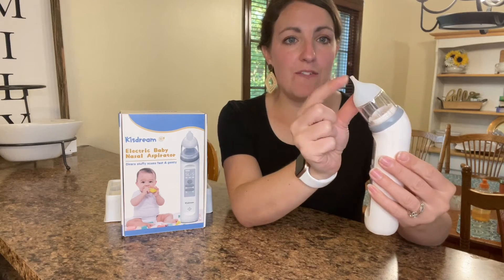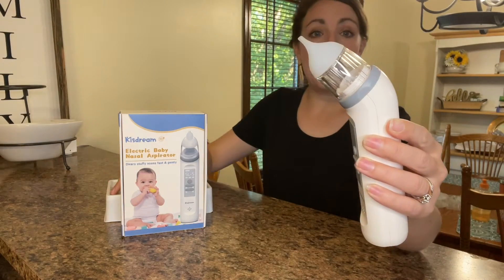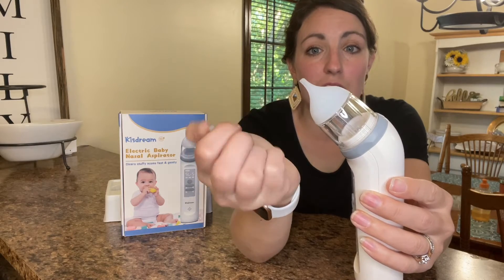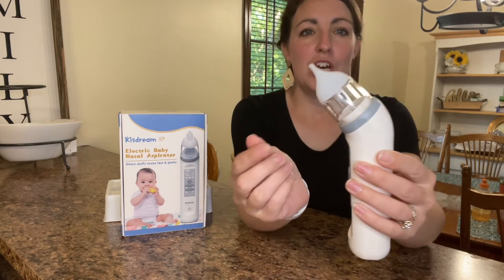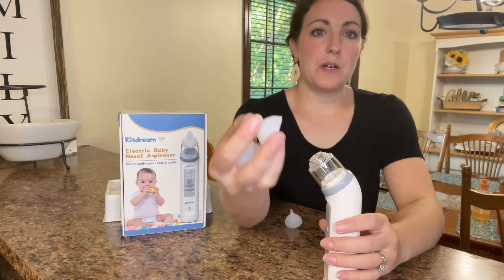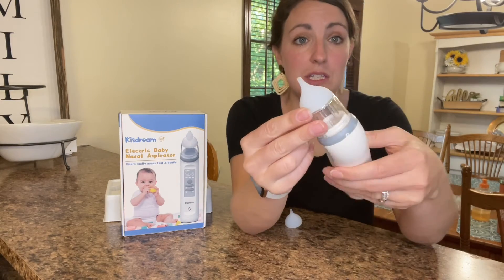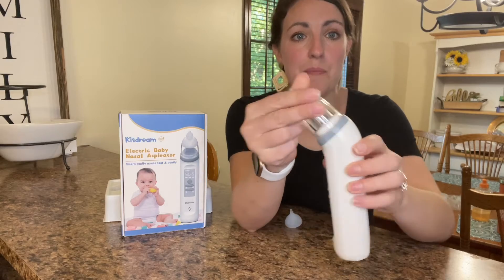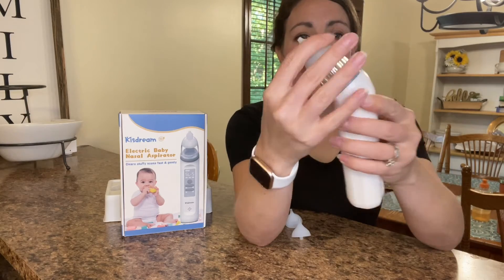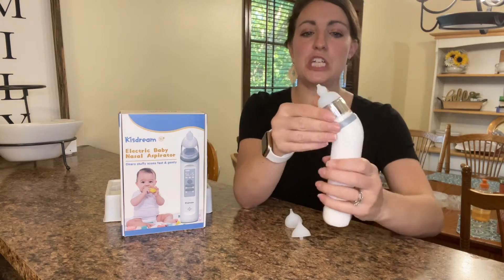It does come with three different size adjustable tips, and the difference is dependent on baby's nose shape and the age of your little one. You have the really thin small one for zero to six months, then from six months to a year old. It also depends on how congested baby is, and then you have up to two years old — which is not an option I've had with other ones that I've tried, so I really appreciated that.